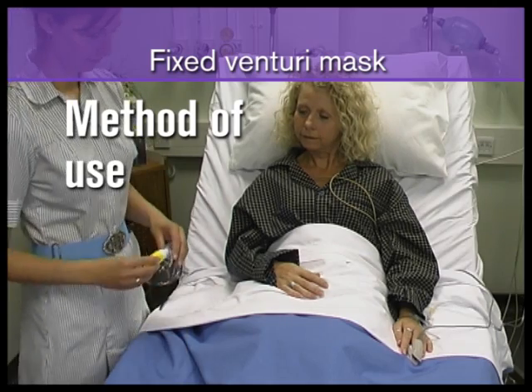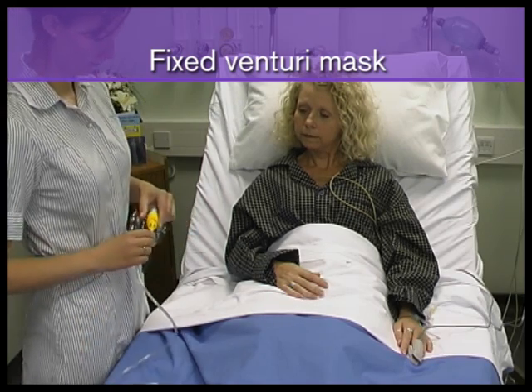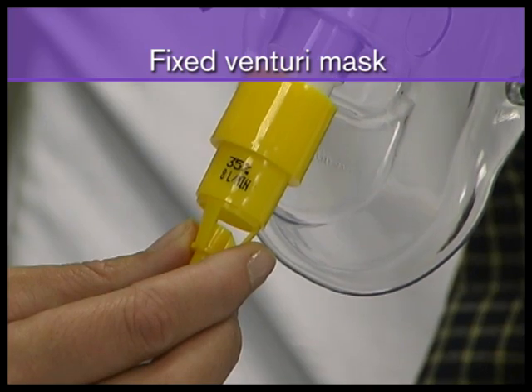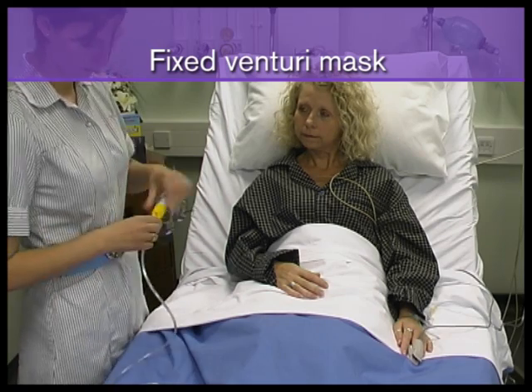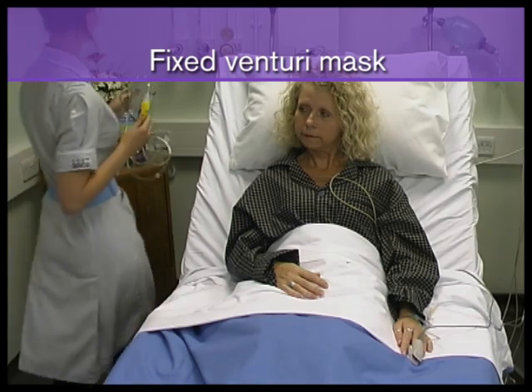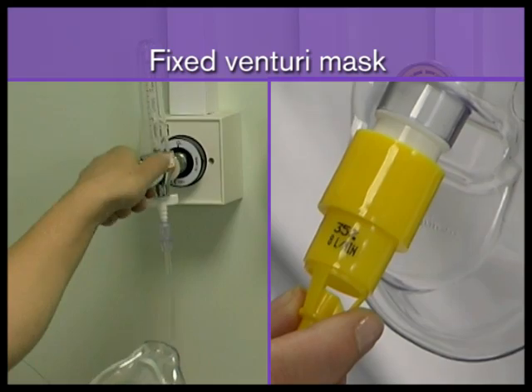When using a Venturi mask, select a Venturi valve of the prescribed oxygen concentration and attach it to the mask. Attach one end of the oxygen tubing to the valve spigot and the other end to the oxygen flow meter. Set the flow meter to the flow indicated on the valve.